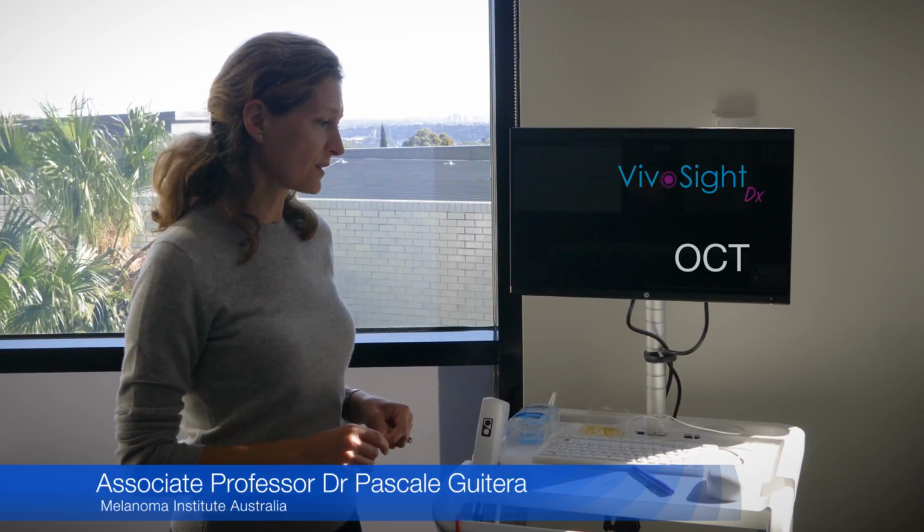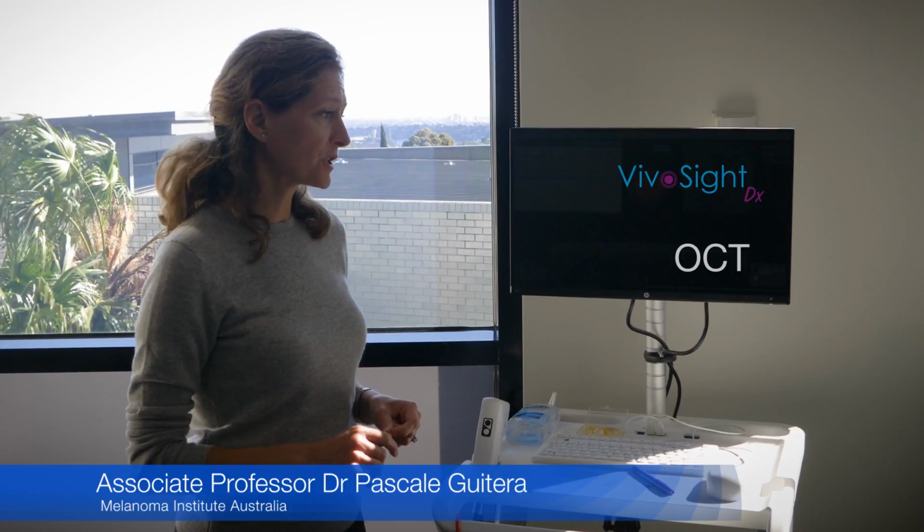And how does it work in Australia? Because it's quite different how the dermatologists and the plastic surgeons and everyone is set up. So I'm wondering who the OCT machine is right for, because previously in Europe, for example, with Dr Welzel, they're quite big on Mohs surgery, but here a lot of dermatologists tell me that Mohs surgery is not so big. It's a little niche. So yes, Mohs surgery is not for everybody. And clearly the machine can help to pre-Mohs. I don't think the machine needs to be with Mohs surgeons only at all. I think it's really good to have it in a center where you see a lot of BCC, but that will be a lot of centers in Australia. It's the number one disease in Australia.